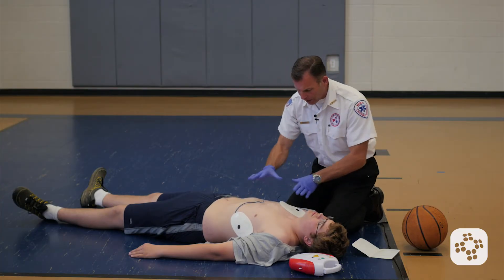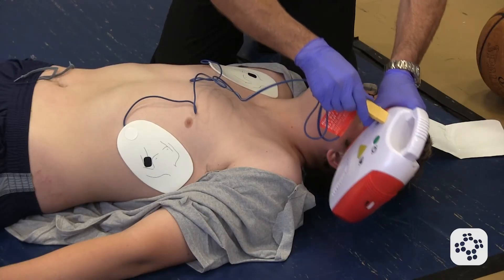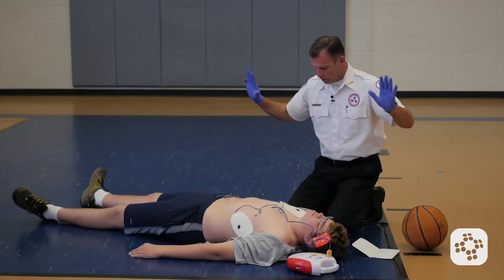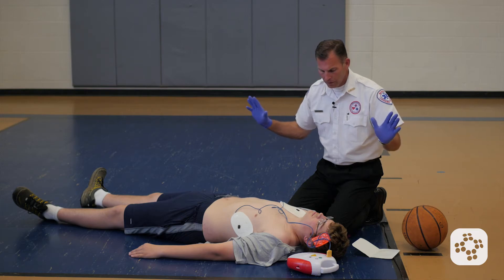These are actually sticking quite well, so now I'm going to go to the last step, which is plugging in the connectors. The AED is now analyzing rhythm. Everyone stand clear — make sure not to touch the patient, don't bump them. Shock advised. Charging. Everyone stand clear.